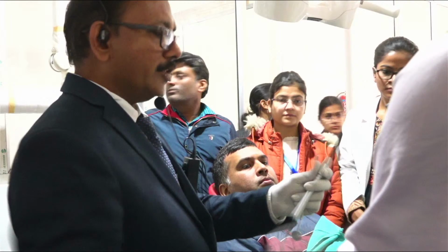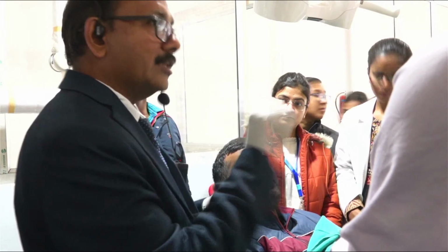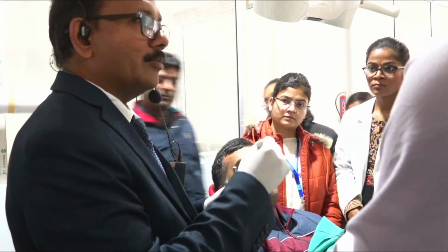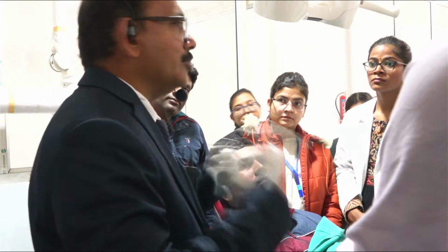So we have this 8 mm probe and 3 mm also. Whenever going into the sulcus, always go for 3 mm. It is very pointed, but the energy delivered will be much more.